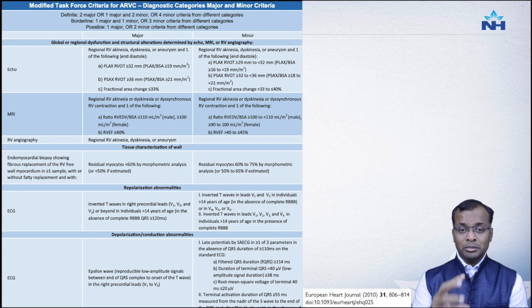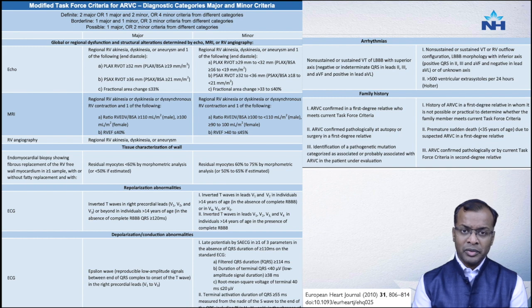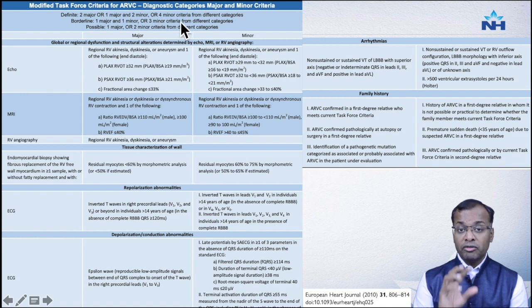This is one part of the revised task force criteria, and this being the second part of the revised task force criteria. Few important pointers that all of us have to know and maybe revise is that to make a definite diagnosis, we need two major criteria, or one major criteria with two minor criteria, or we need to have four minor criteria across all the different modalities.